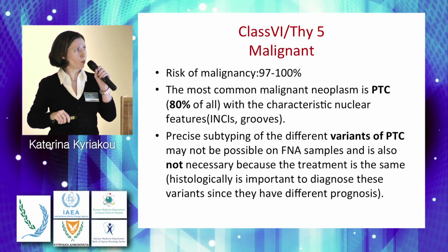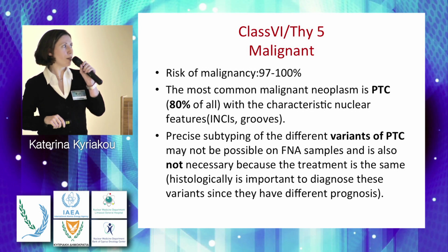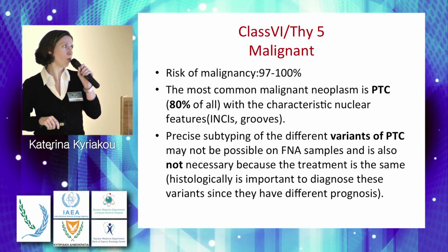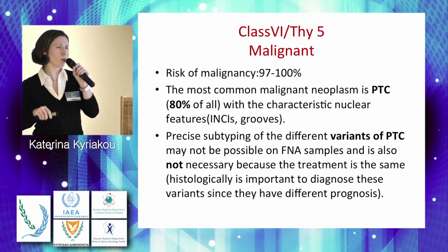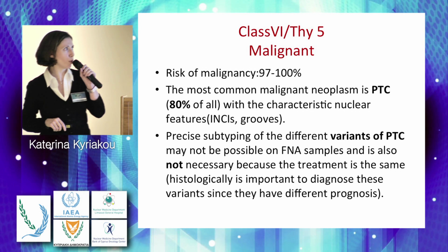Precise subtyping of the different variants of papillary thyroid carcinoma may not be necessary in FNA samples. It may not be possible on FNA samples, and it is also not necessary because the treatment is the same. Histologically, it's very important to diagnose these variants because they have different prognosis.